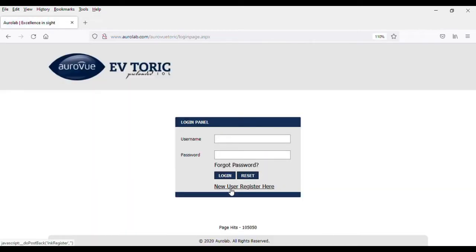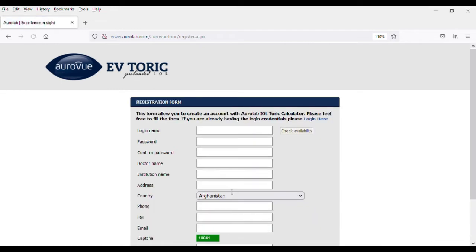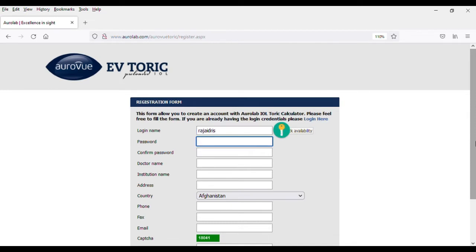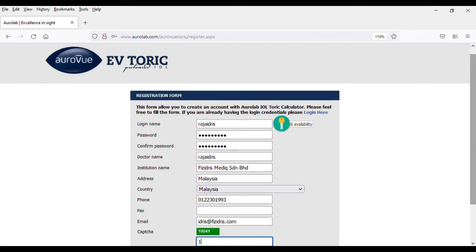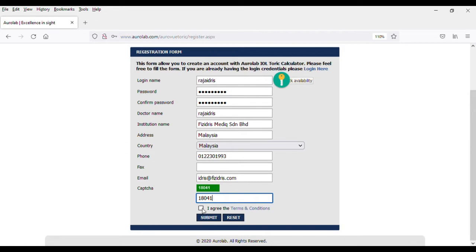For new users, please click on New User Register here. This is a simple step to create a login ID for new users. Fill in your particulars on the Registration E-Form. Next, please check the box to agree to the terms and conditions, and click Submit.